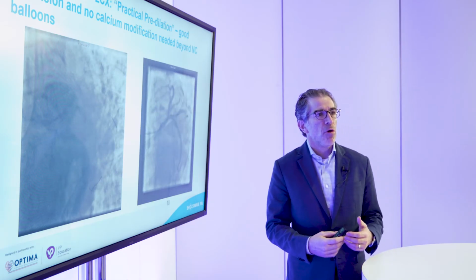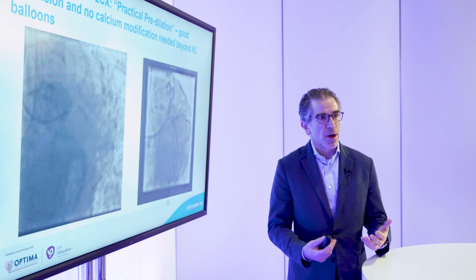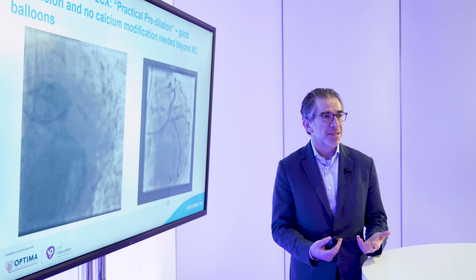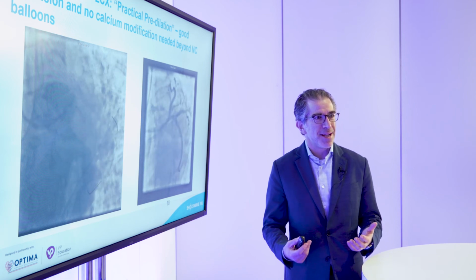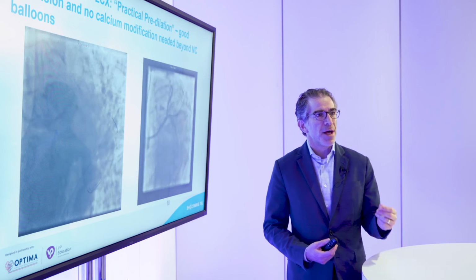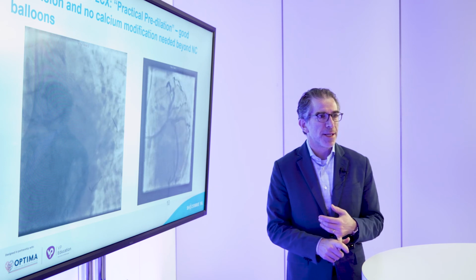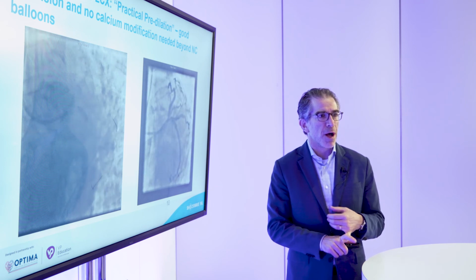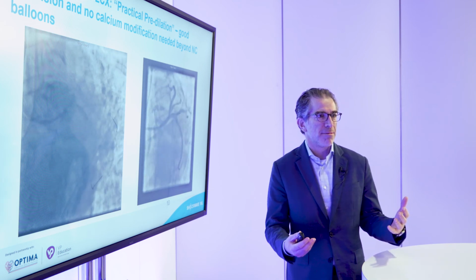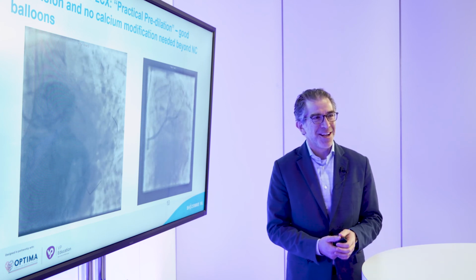In terms of what is next for coronary IVL therapy, now that Disrupt CAD I through IV are completed, showing the safety and effectiveness of this therapy in stable CAD, I think where we need to go are patient and lesion subsets that weren't studied in those trials. Particularly acute coronary syndrome: there are cases, especially older patients with both non-STEMI and STEMI, with highly calcified lesions. So in that setting, is coronary IVL safe and effective? An important question that hopefully will be answered in the coming months to years.